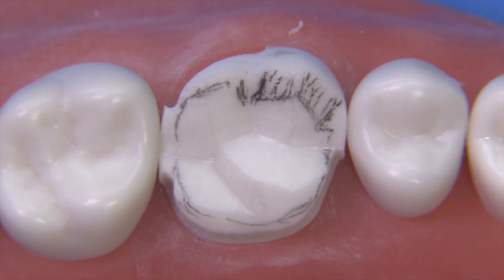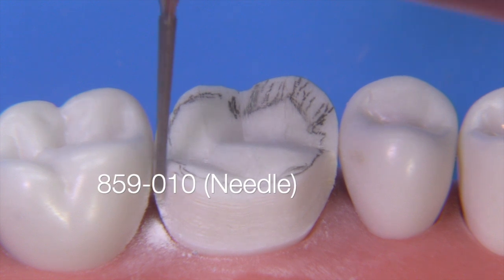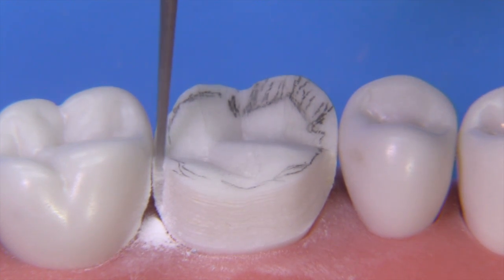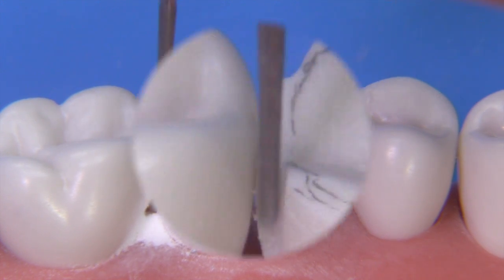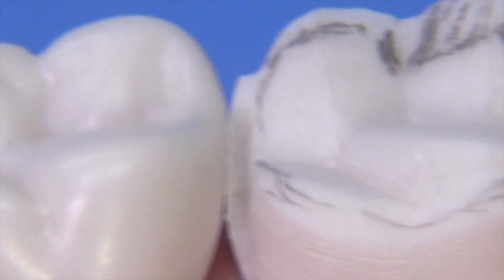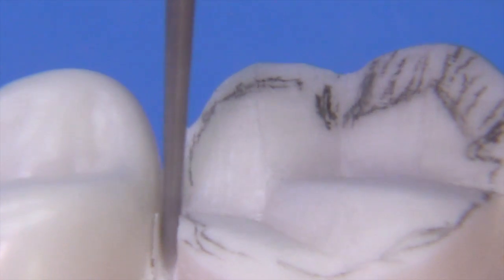Now it's time to utilize the 859010 needle-shaped burr. As we've done in the past, it's a matter of doing stepwise work — I like to think of this as going up an escalator at an angle. You're not trying to push the whole burr through, but making little steps as you go from the gingival to the occlusal. This would be the view I'd normally get with 12-power on my microscope. I'll turn it up to 30-power when refining the finish line at the end, but when breaking through a contact you don't want to get too close because you can lose perspective of where your burr is angled.